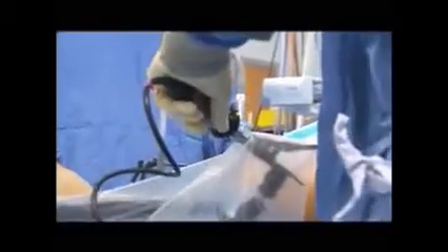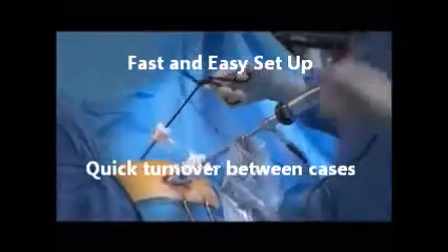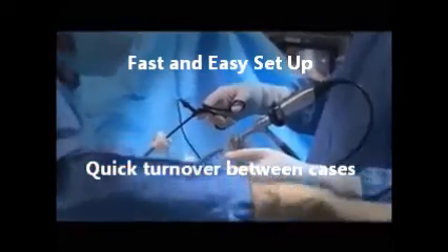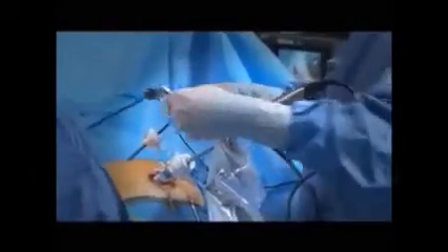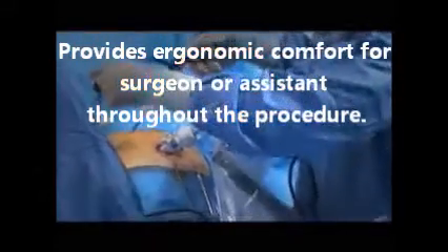The laparostat is durable, requires minimal maintenance, and can save time both between and during a surgical case. It also can eliminate the need for an assistant in simple cases and significantly reduce the burden on the assistant during long or otherwise demanding procedures.